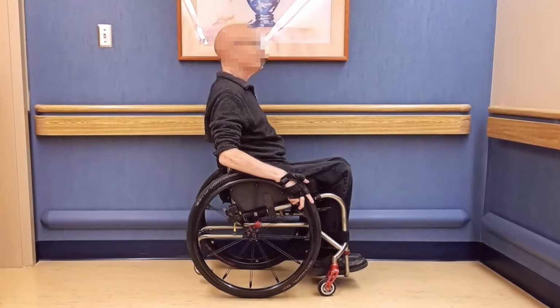His shoulders gave out, but he used to do wheelchair dance and a lot of hand cycling and a lot of athletic activities. But if you also notice, there's a little third wheel anti-tipper on the back because the chair is set up so tippy that it doesn't take much to send that over. So he's not going to be able to get a lot of applied force into the pushrims to go really fast forward, but he's able to get around on a smooth surface with fairly little effort. And the seat angle is kind of typical tetra, where there's more seat slope, and down lower in the wheels because he doesn't have hand function.